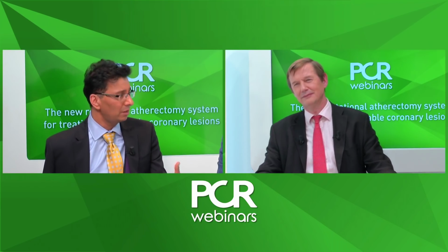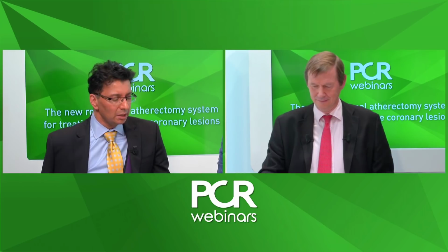Sagar? I think absolutely. I would agree certainly with Bruno's comment that you use a small burr size, but clearly if it's clinically indicated, if you have nowhere to go, the patient has no option for surgery, then you have to take it, but accept that there is an increased risk. And I think that's also important in the decision making and counselling of the patient and their family. But to make a comment also, what you can sometimes get in those very, very angulated lesions is the wire gets buried into the plaque.